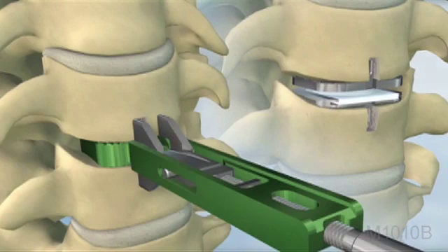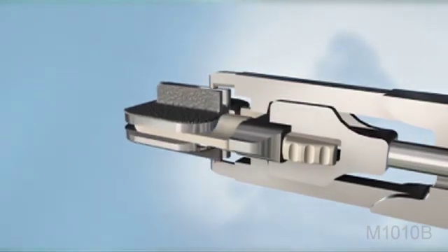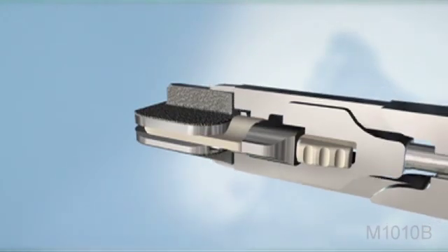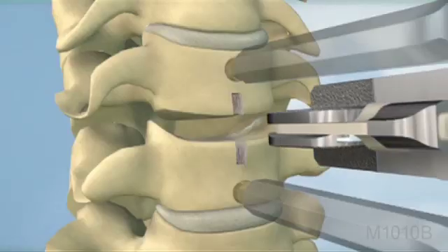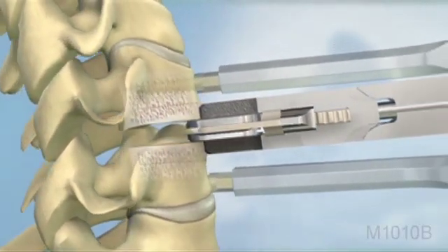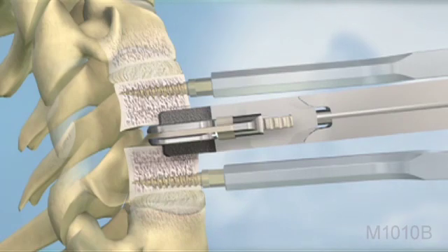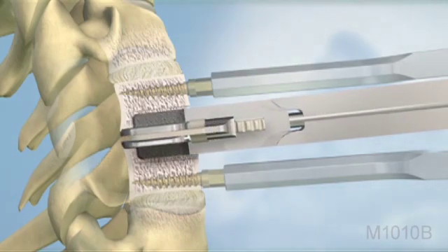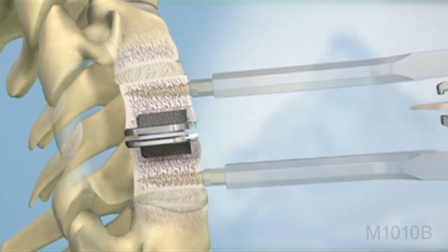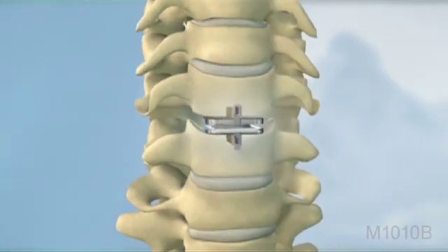placement of the trial. After the keel channels have been prepared, the vertebral bodies are ready to be implanted with the Prodisc C implant. The implant is attached to the inserter, the keels are aligned with the keel channels, and the implant is inserted en bloc into the vertebral bodies. The instruments are removed and the final implant placement is confirmed.